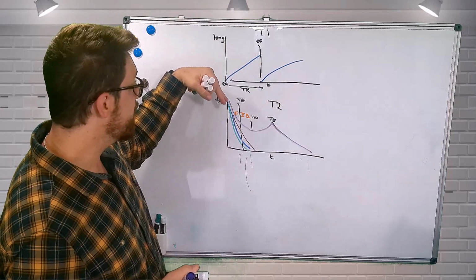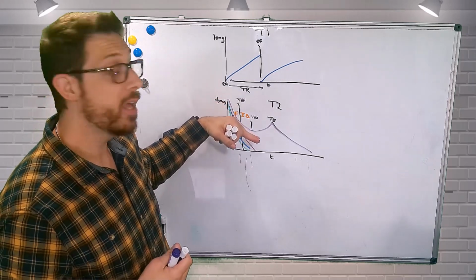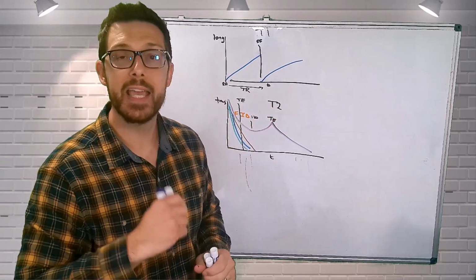So we're getting this free induction decay, I utilize a 180-degree refocusing pulse, I regain phase coherency, and I get my TE time maximum signal, and I take a sample at that time.